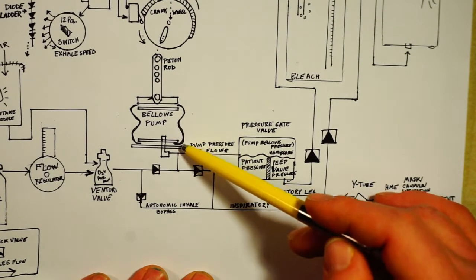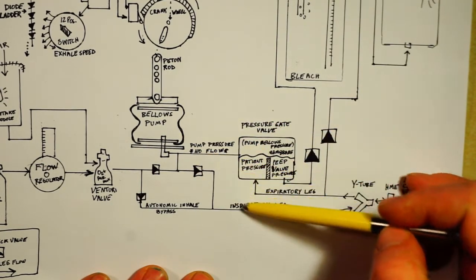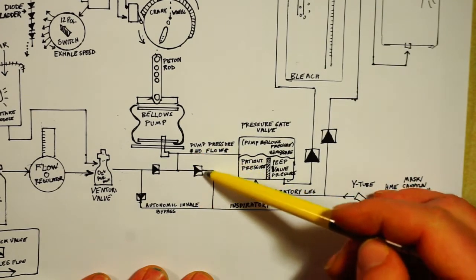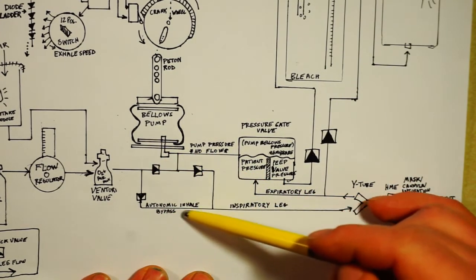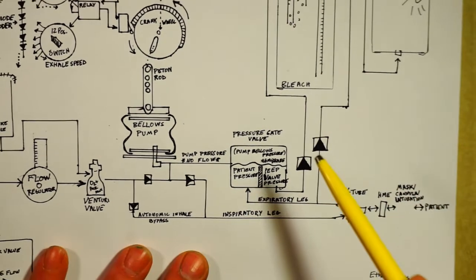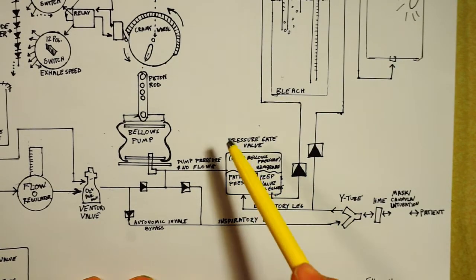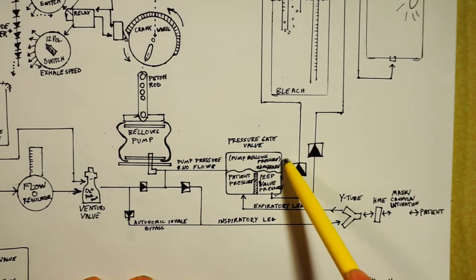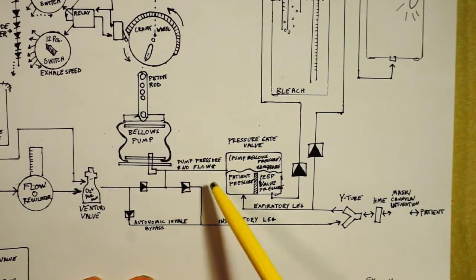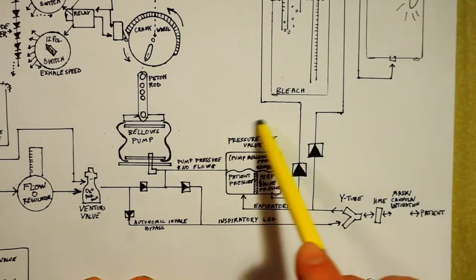However, if the bellows is inhaling quickly and the patient is only weakly inhaling, we are unsure that this check valve would open, and so that's why this inspiratory bypass leg is in the system. Okay, so now what I want to do is take a look at a schematic of this valve. We have a CAD cross-section of it, so we can take a little bit better look at how it works. And then we'll take a look at this compound valve block that includes all of these valves in one piece.